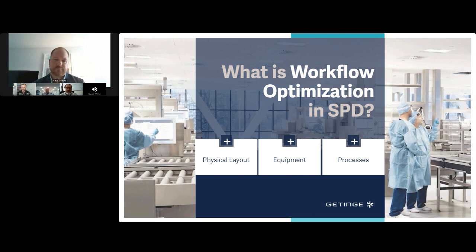That's perfect. And in addition to that physical layout and that unidirectional flow, that's really important to prevent cross-contamination and really important from a Lean Six Sigma standpoint of not wasting a lot of steps in human motion. There's others that go into it as well, because you can have a great layout but still have bottlenecks. So talk to me a little bit about the equipment piece of this as well. What does equipment have to do with it? One of you other guys jump in there.